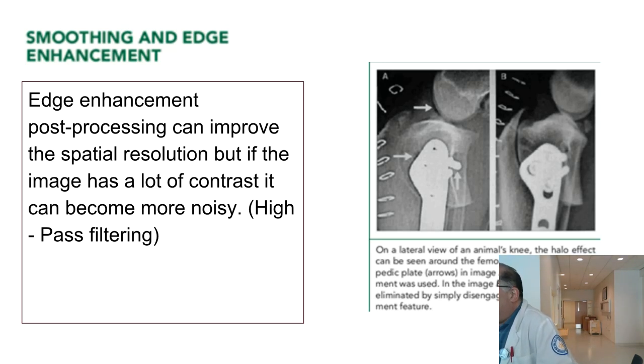And it's that image data that's kept on file, so to speak. What do you learn in patient care? Is it 7 years before x-rays can be destroyed? But now we don't talk about sheets of film being sent off to some warehouse somewhere. Now we're talking about how long do you keep the digital data, right? It does get confusing too, because in CAT scan and MRI, where you create some of these fancy images, which creates even more data, right? I think I mentioned that last week. When you want to create some 3D images, you have to make another data set, right?